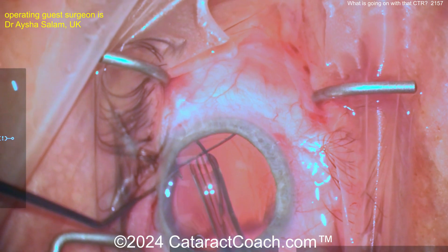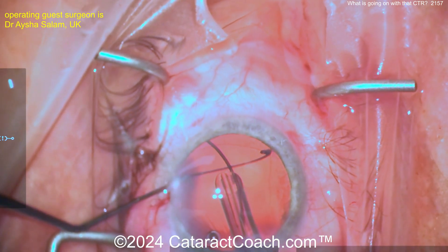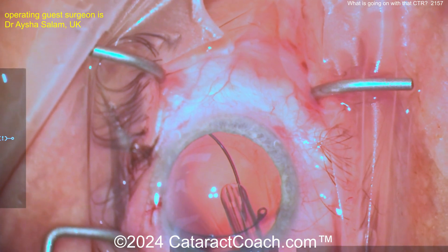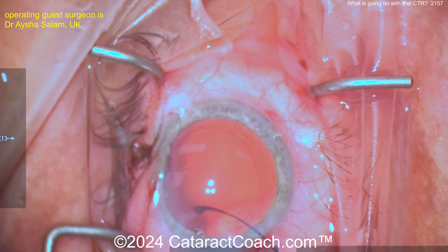You've got to be very careful inserting. The CTR can easily break the capsular bag, break zonular support, etc. Now it looks like it's kind of going in but it's in a really odd position. Get that one eyelet in the bag.